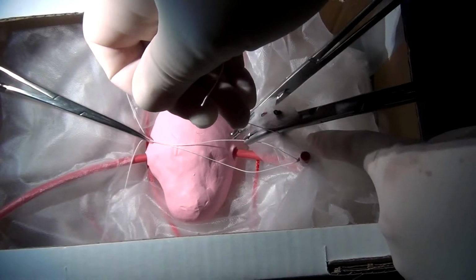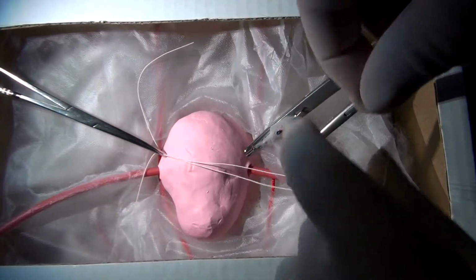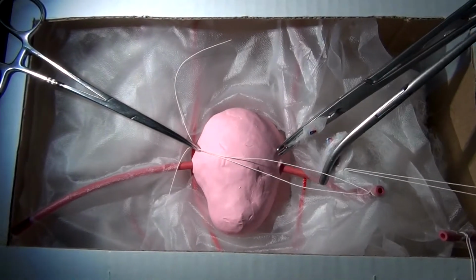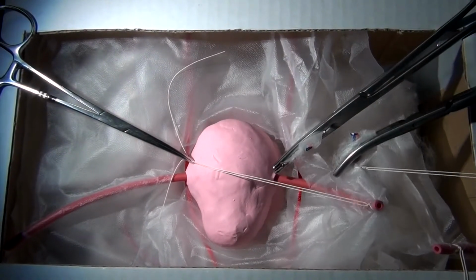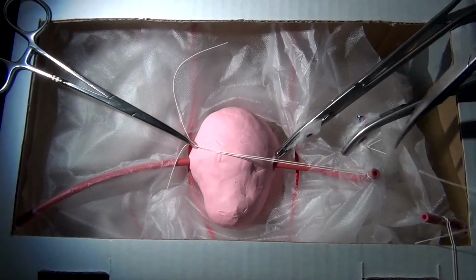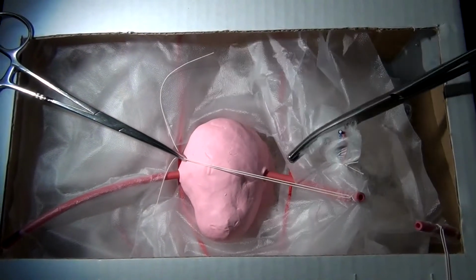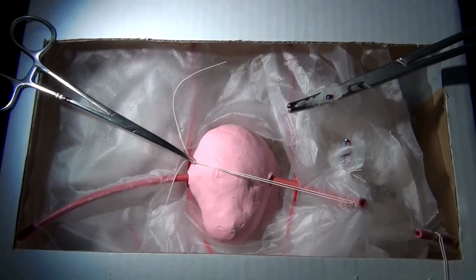Go ahead and flash that for me. Notice that I'm tying down to the vessels as opposed to pulling up on the vessels because I don't want to avulse the vessels. Typically in the operating room, we would never rely on one suture for our infundibulopelvic ligament, but for the sake of this simulation, we're going to rely on one. I would have put a second tie around here, and sometimes people put a third suture ligature around this. You can take that off. Take a 0 Vicryl tie again, so I can tie off the other part of my pedicle. Around.